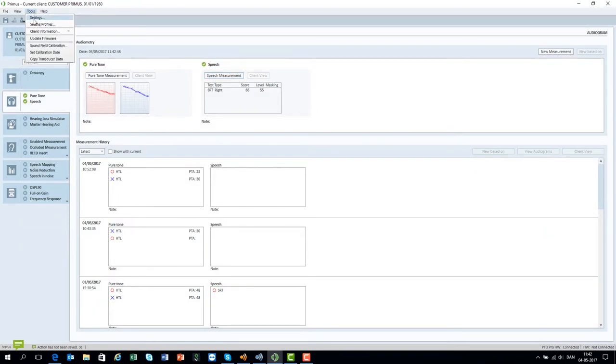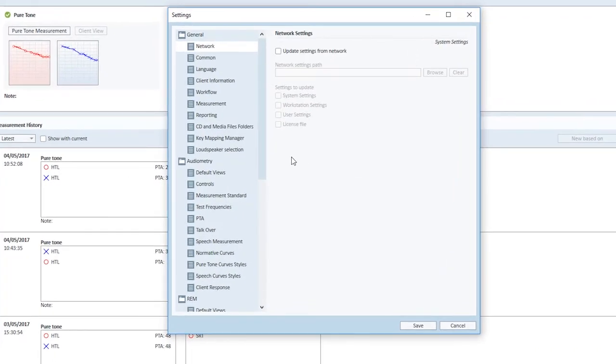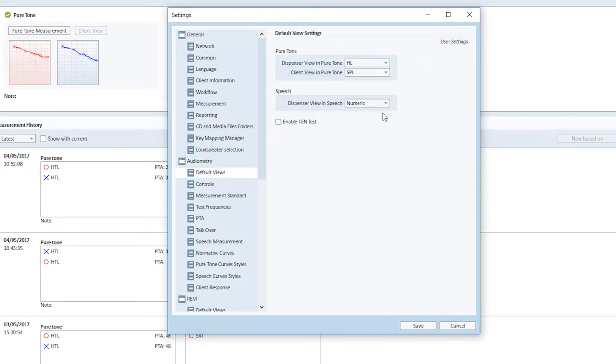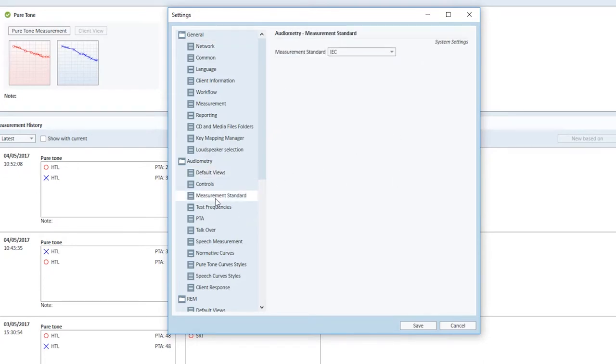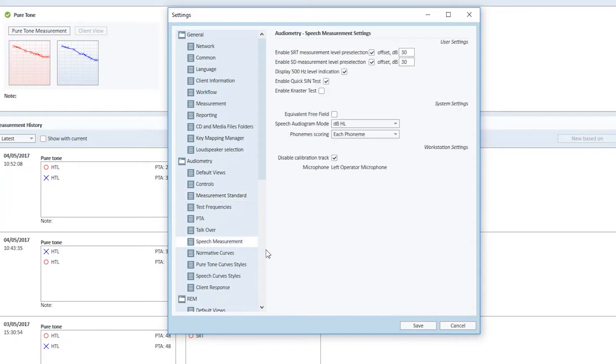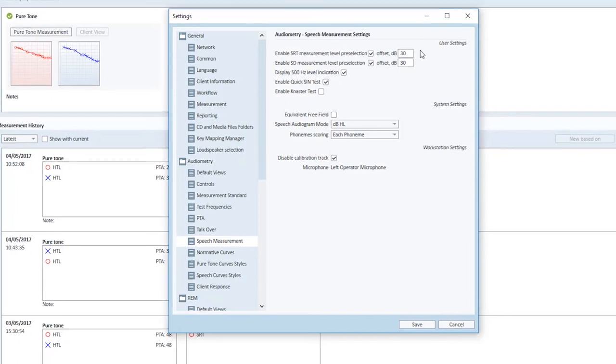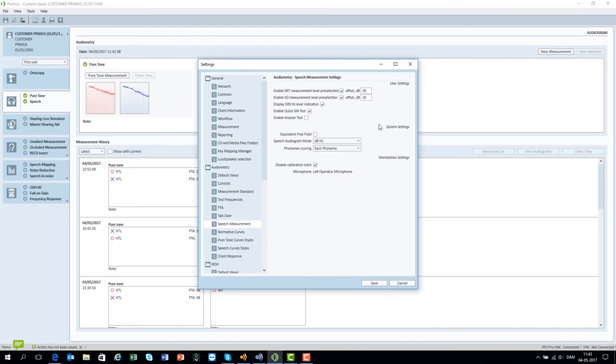You can configure settings for speech audiometry in tools settings default views to choose a graphical or numerical representation of the speech audiometry. Select the measurement standard to suit the requirements in your country. Speech audiometry offset can be configured in settings audiometry speech measurement. Here you can also decide how you want to score the words from the word list. You should now be good to go.